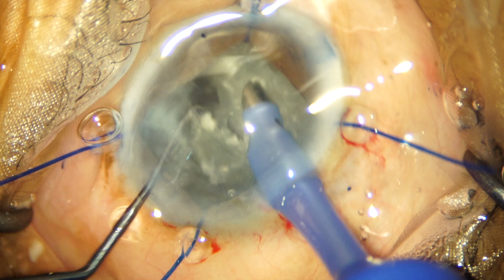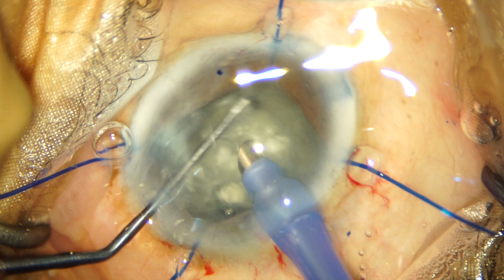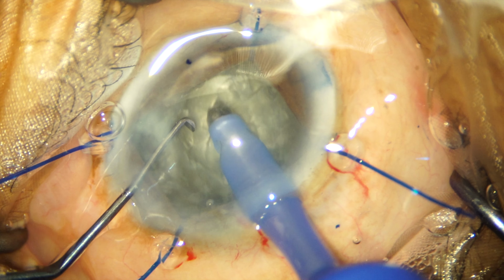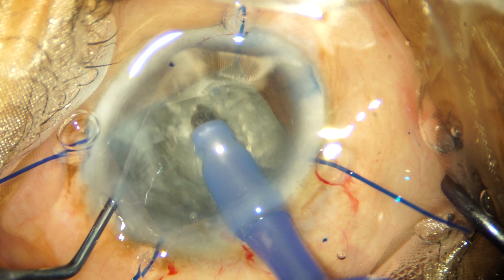So I'm able to achieve a chop in this instance, and immediately I notice that the chop is unequal and one fragment is much larger than the other. Generally, friends, you will notice that this kind of chopping occurs when there is a posterior plate of the nucleus.